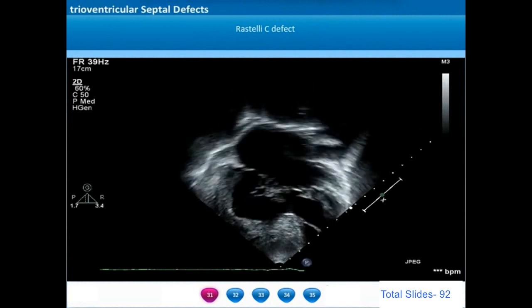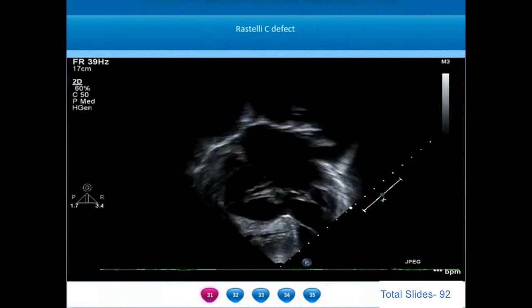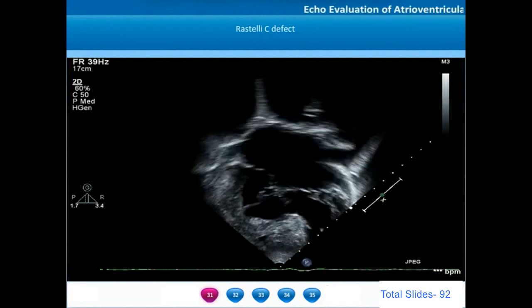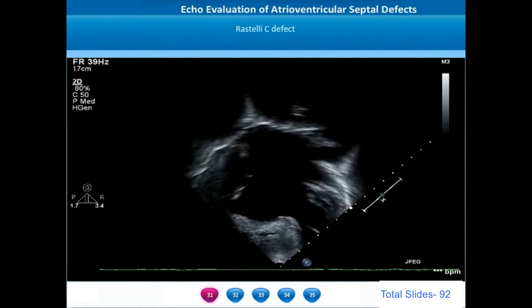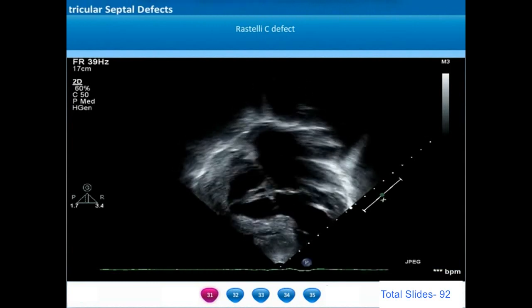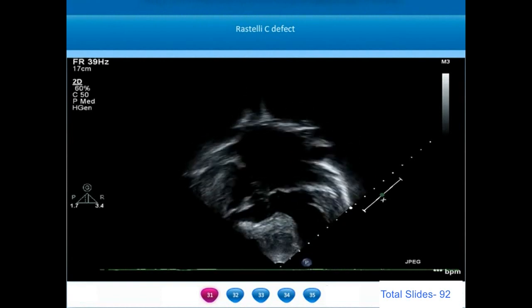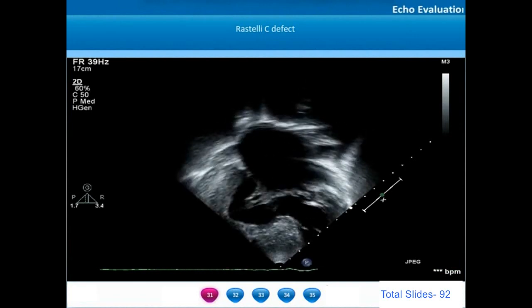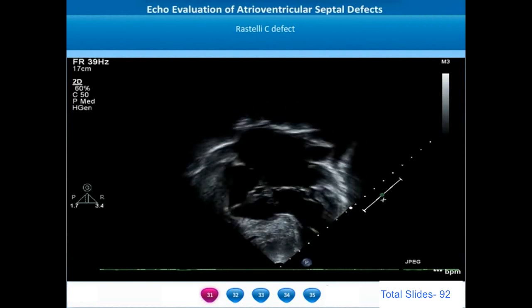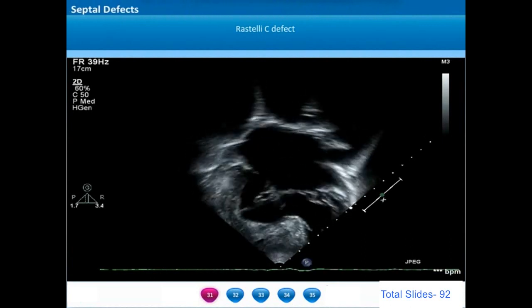In Rastelli type C defects, the bridging leaflet cordae do not have any attachment towards the crest of the interventricular septum or the right side of the septal surface. All bridging leaflet cordae attach towards the free wall of the right ventricle. In this example, we can appreciate a grossly hypertrophied right ventricle with a very large inlet VSD, and bridging leaflet cordae attaching to the right anterior free wall.